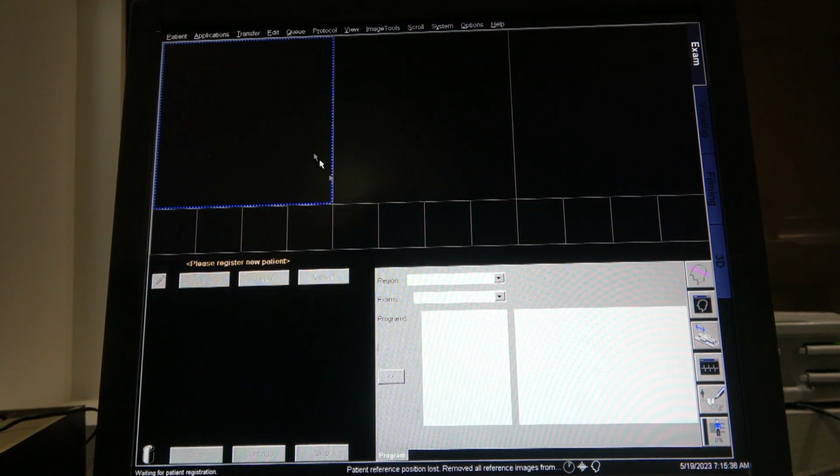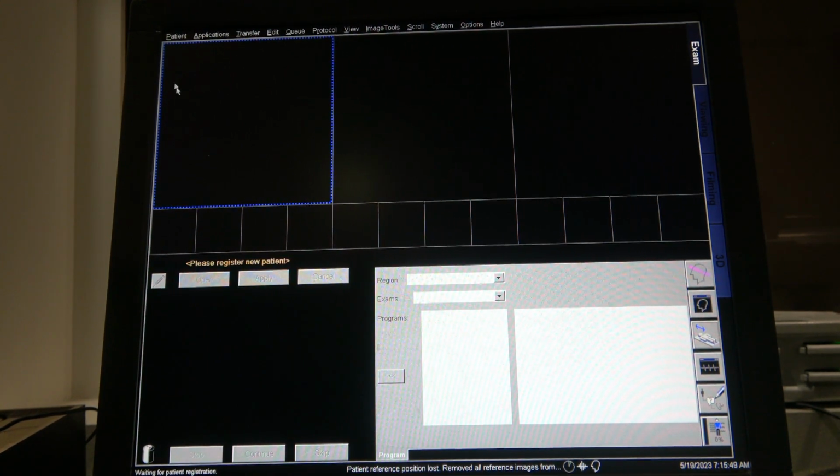Alright, we're back for another video. This time we're going to do a pelvis, a female pelvis. Female pelvis. Alright, so let's register the patient.